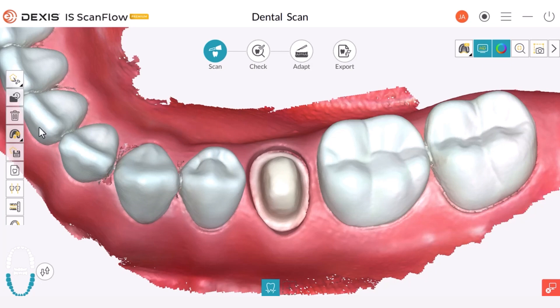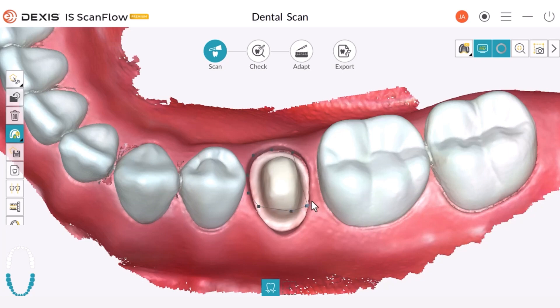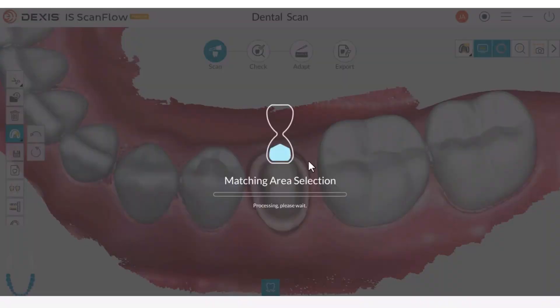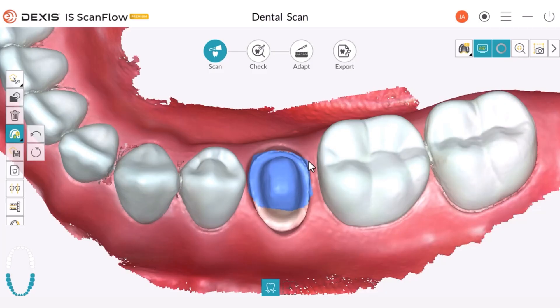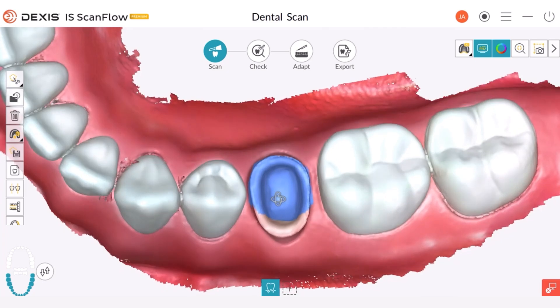To engage the lock tool, simply click on this button which will turn blue once selected. With this tool activated, you can select the specific area that you want to lock by left button clicking. The locked area can be an entire prep or just a portion of it. Double left click to finish and the marked area will be highlighted in a distinctive royal blue color to indicate that it's now locked and that the scanner cannot see it.